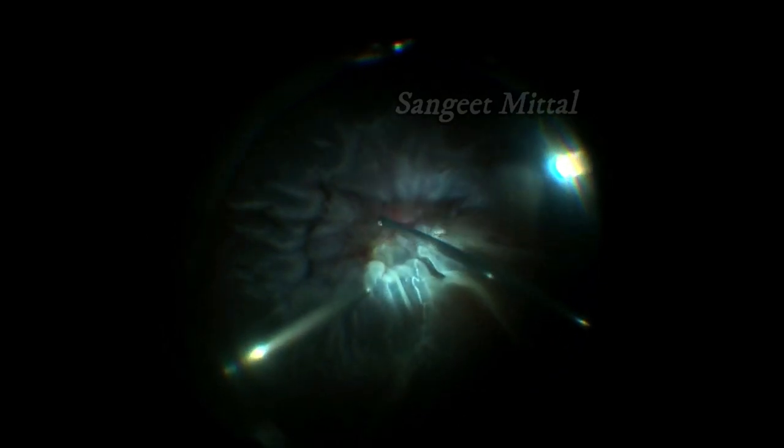Grasp the membrane posteriorly and pull it in a posterior-to-anterior direction. Stop when excess pull is exerted on the retina. Move closer to the retina in that area near fixed folds and repeat the maneuver. In this way, slowly the whole membrane can be peeled.